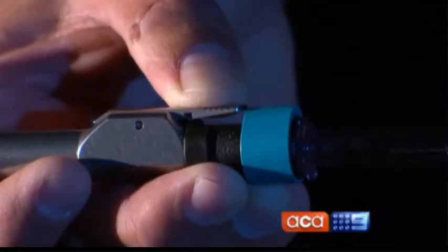It can also be used to administer vaccines and insulin to diabetics. It's certainly a wonderful process that now is available to the public, which is fabulous for people who are suffering from that phobia. I don't think it's going to replace needles altogether, but it will serve a very important purpose for those who have needle phobias or for those who need to have procedures in particularly sensitive sites.